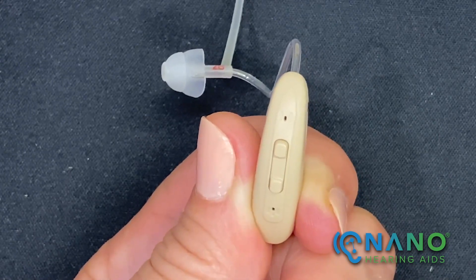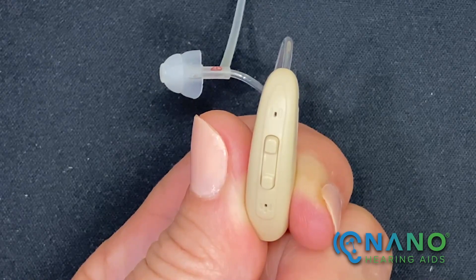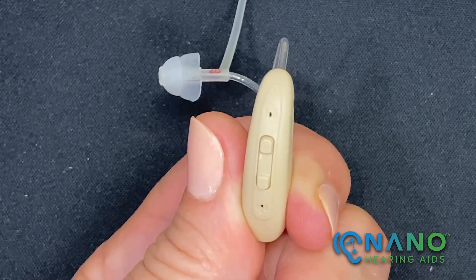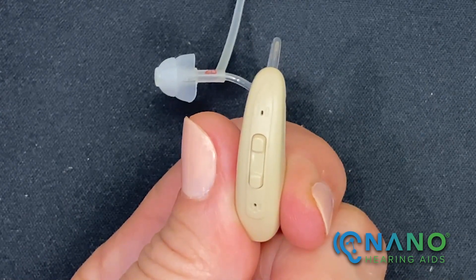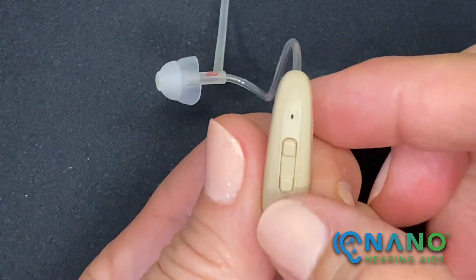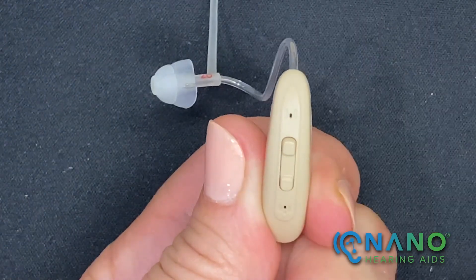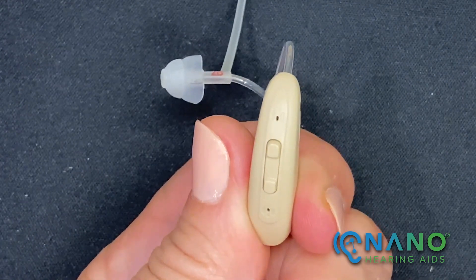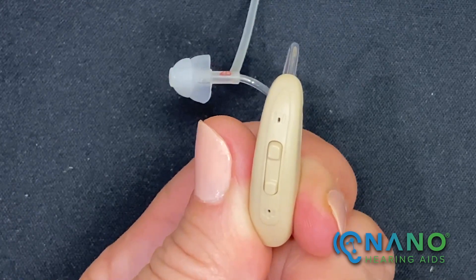For more information on the programs, please reference the user manual found on our website, nanohearingaids.com. To turn the hearing aid off, press and hold the lower button for three seconds — you'll hear three beeps. As a reminder, please always turn your hearing aid off prior to placing it in the charging case.